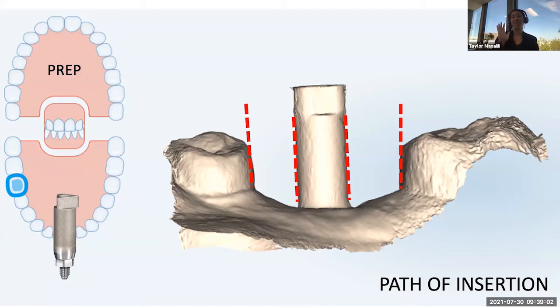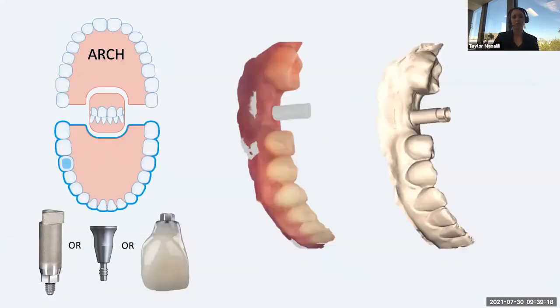If anything is not to your liking, you can simply, at this point, go in, quickly adjust it intraorally, and rescan this prep very easily. So really no time wasted there, and your delivery day is going to be so much easier for you if you do this.